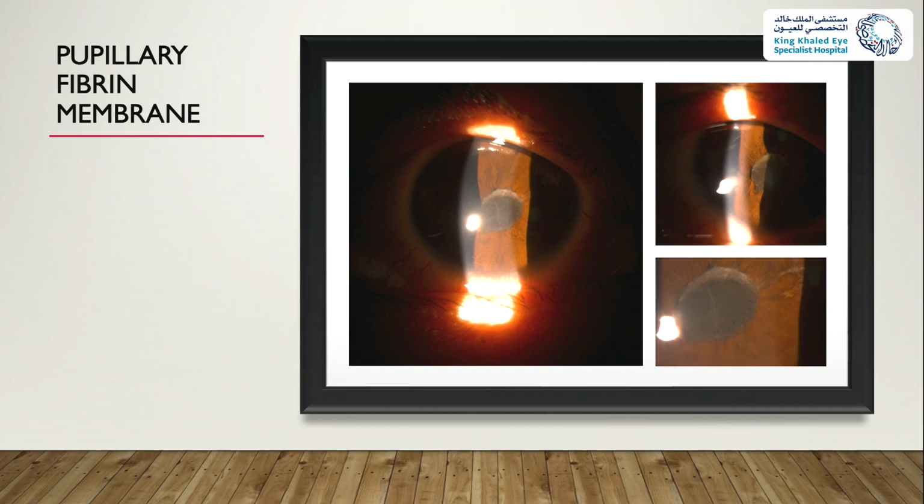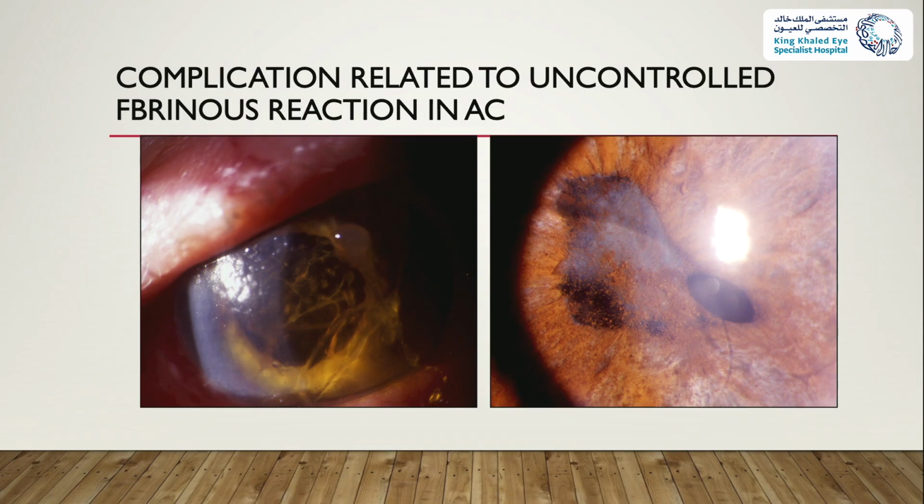Any questions so far? Sometimes you have a pupillary membrane in the anterior chamber after surgery, especially when we operate in young patients or patients with uveitis, because of very exuberant reactions. It is a problem for two reasons. One is it limits our ability to see in the back of the eye. But also that fibrin membrane, if we leave it for too long, can cause secondary problems and become structural, actually forming a fibrous membrane.